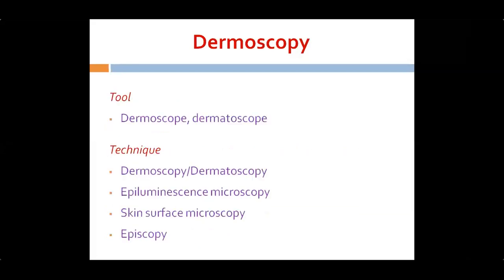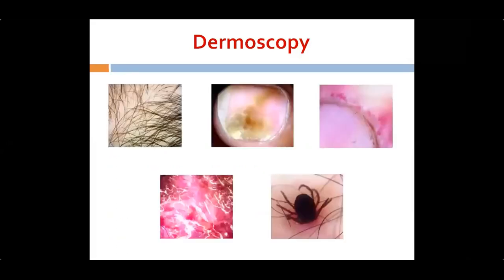So the tool has been named as dermoscope or dermatoscope. The techniques are known as dermoscopy or dermatoscopy commonly, and certain other terminologies like epiluminescence microscopy, skin surface microscopy, and episcopy are also employed. And depending on the application, dermoscopy has been given various names.